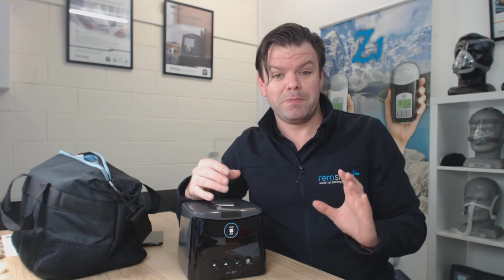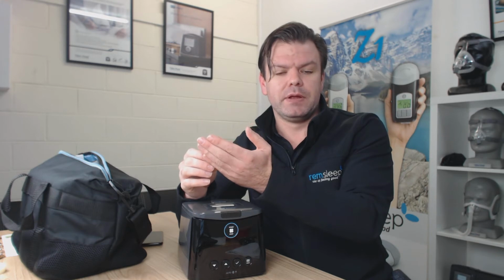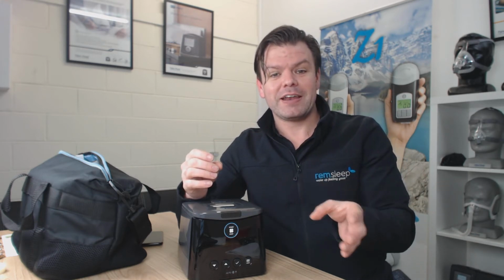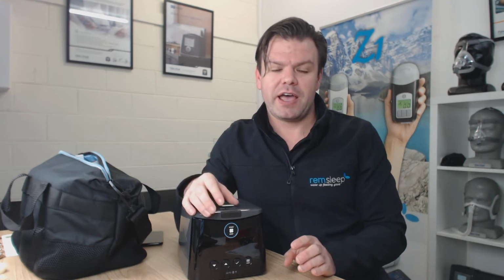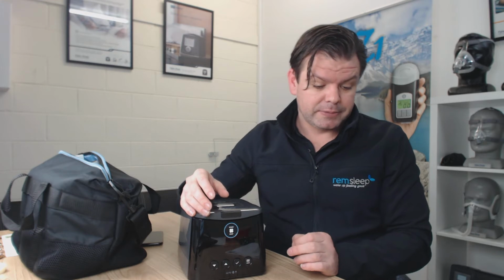And if you wake up during the night, whatever the reason, a bad dream or a good dream, the machine will drop the pressure again to help you get back to sleep. So the machine knows when you're sleeping and when you're awake. It's a bit creepy like that, but it's a very handy feature, okay? And a lot of our patients really love it.